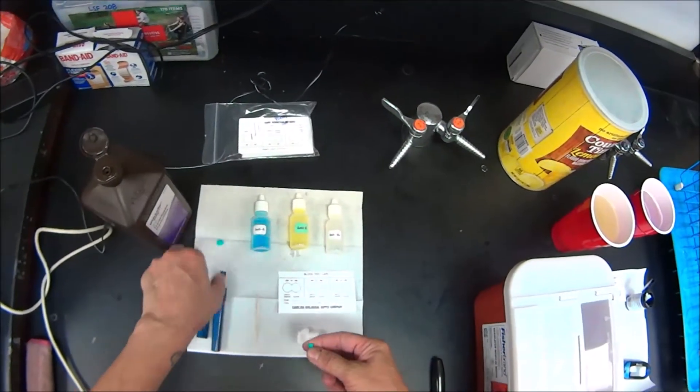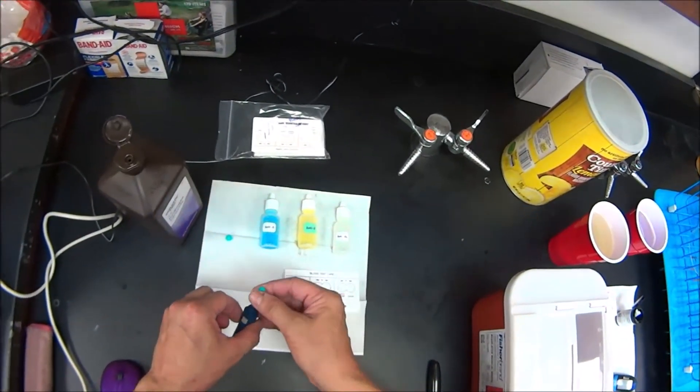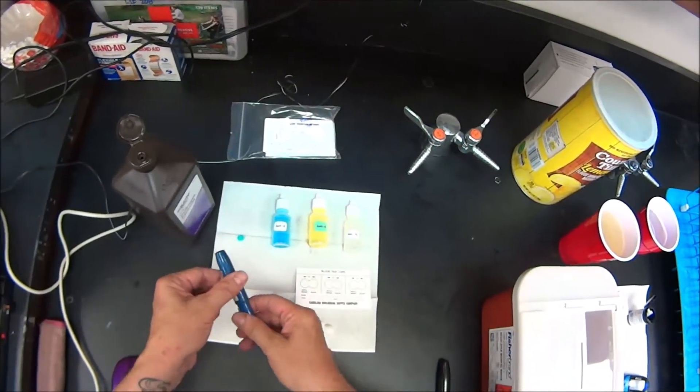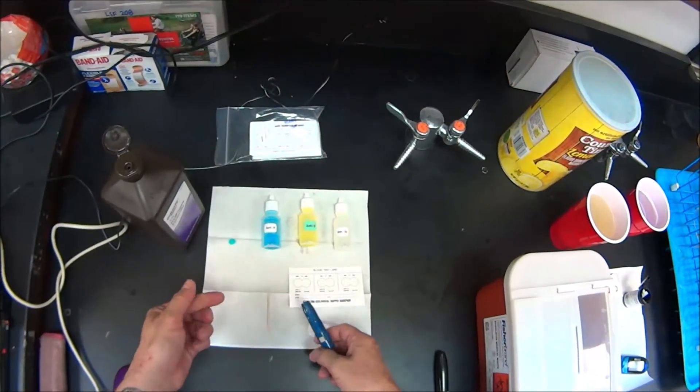Take the cap off your lancet. Put the lancet in the holder. Alright. Cap that lancet again. Cock it. It's ready to go.